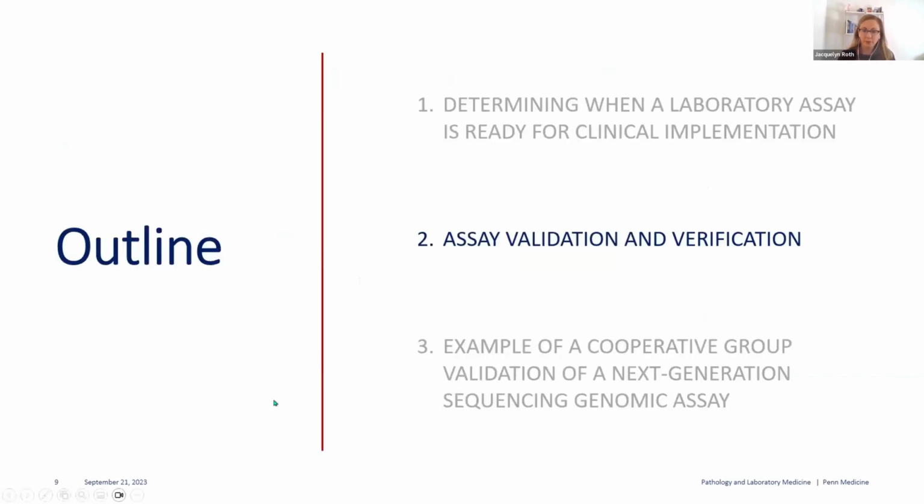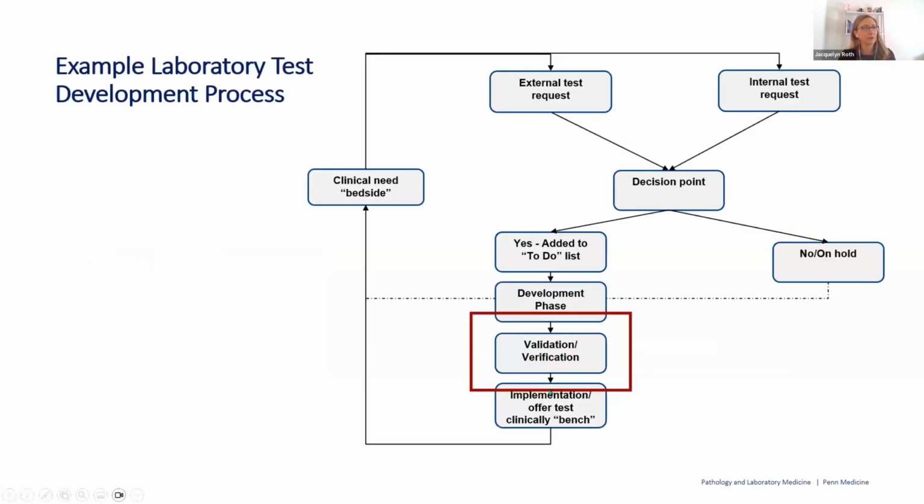After this decision point to move forward, I'll now get into talking about what we do in order to verify or validate an assay in the lab. And that's at this point here in our lab test development process.